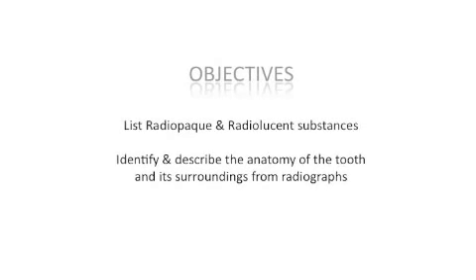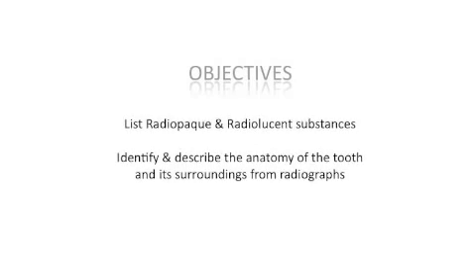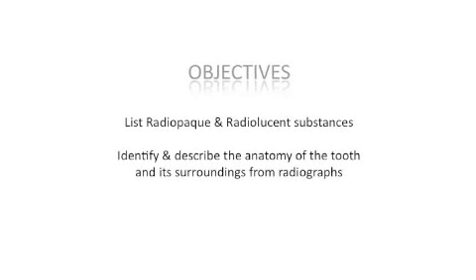List radiopaque and radiolucent substances. Identify and describe the anatomy of the tooth and its surroundings from radiographs.